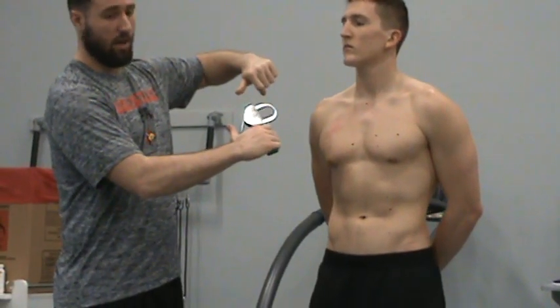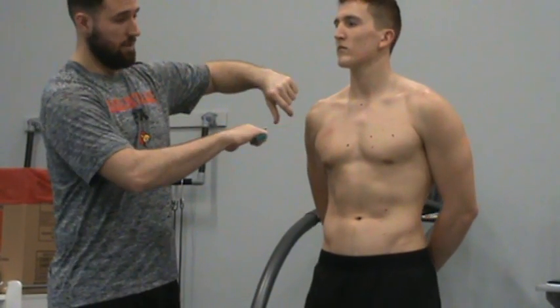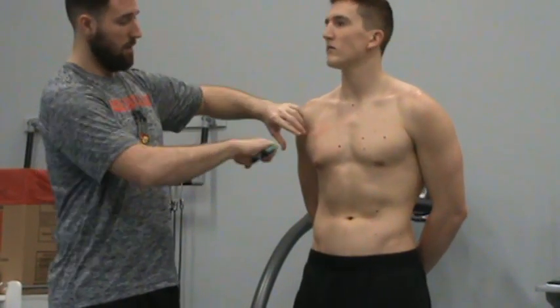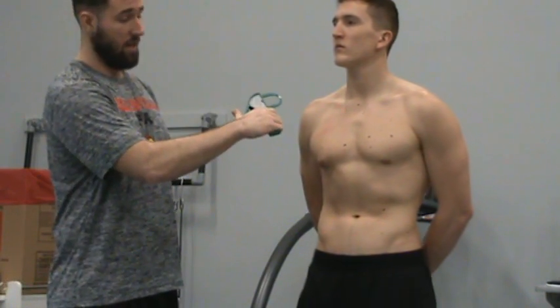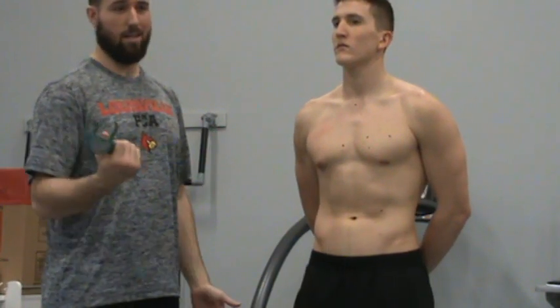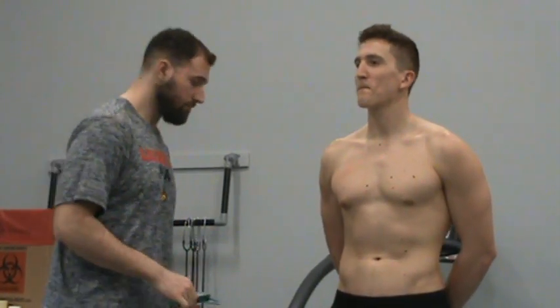So I get in there, let go, get my reading real quick, push back on the thumb to release, pull away, and then pull the skin away. If I don't do it in that order — if I let go of his skin while the caliper is still on and just try to pull it away — it's going to rip up his skin and he's not going to be very happy. He's already not super thrilled since I'm pinching him all over. So remember that technique. It's kind of a whole process to it.